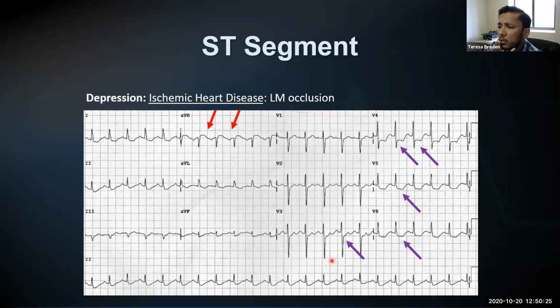So let's look at that left main occlusion that I just told you about, where we try not to avoid the appearance of aVR. Again, I'm not having you guys individually called out to read EKGs. I think I talked about it in the first part, but I just never liked it when I was a resident, and you get a little tachycardia yourself when you're having to read an EKG in front of your classmates. But when you rotate with me on hospital medicine, I will be asking you to read these in front of the team. So we look at the left, or aVR, we can see some elevation in aVR.